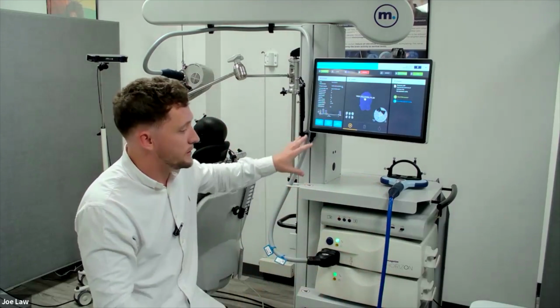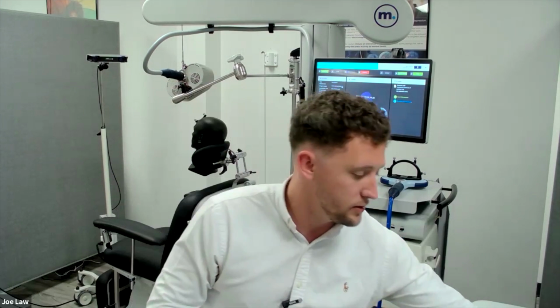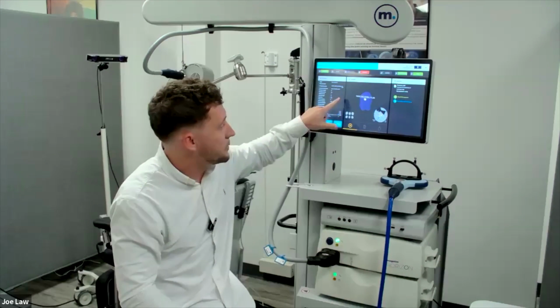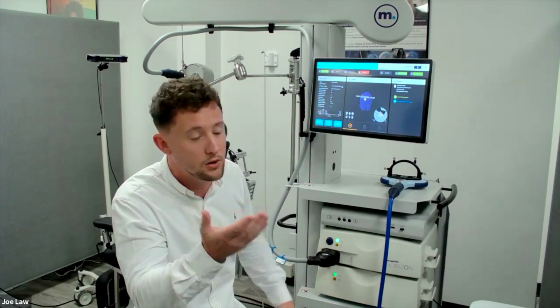What you can also do is plug in some EMG electrodes into the front of this system and stick those EMG electrodes to the patient's thumb. That will pick up any muscle signals within that patient's thumb. So not only will you get a visual response, but any muscle response will get sent back through the electrode and will show up as a sine wave on your waveform. If there's no muscle response, the waveform will be flat. If there is a response, you'll see a nice sine wave on the screen. You can use them in tandem, that's not a problem.